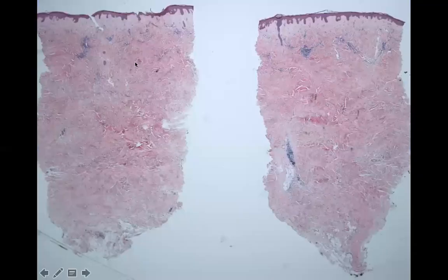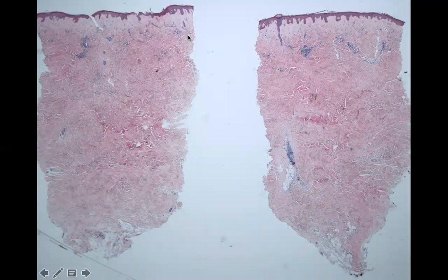So here's a biopsy. Some would argue it's square, but as I talked about in the normal skin chapter, anything from your back might be square because you have a lot of collagen, but you have a lot less space between your collagen bundles than you normally would. And if you look in the inflammation here, you have perivascular, but also a little bit of busyness in the dermis from your inflammation. You're missing your hair follicles. There's not a hair follicle in sight here.